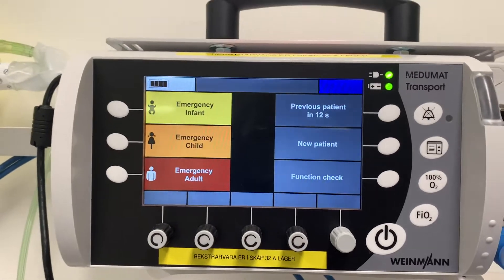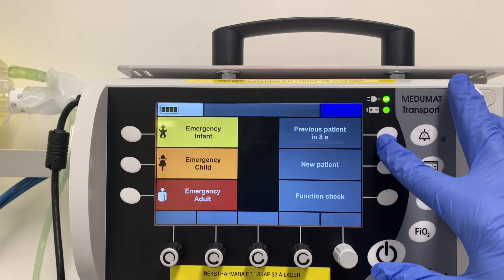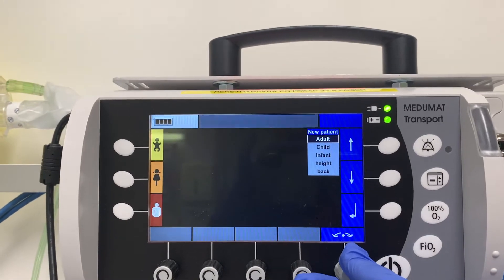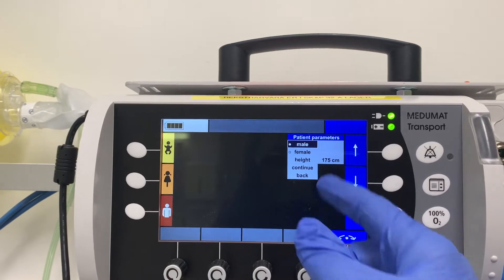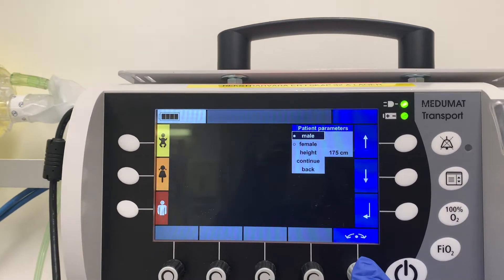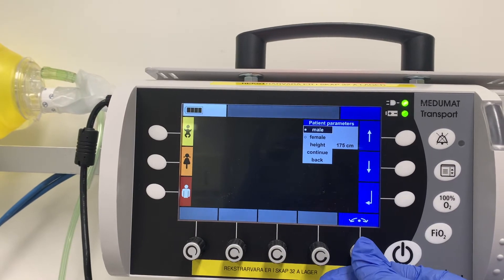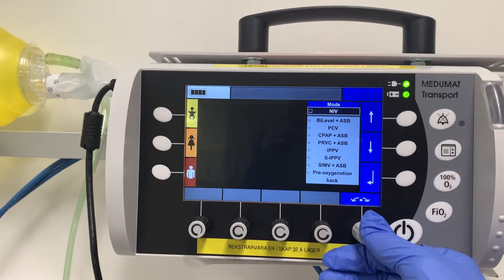We have shortcuts for emergency, infant, child, and adult. If it's the same patient, you can go to 'previous patient,' or you can do a new patient. You can select adult, child, or infant, then enter the height — let's say 1.75 meters, male — and it will calculate the ideal body weight for you. Confirm and continue.